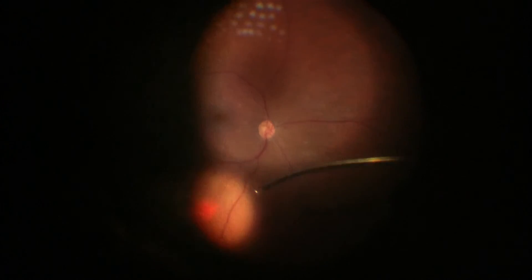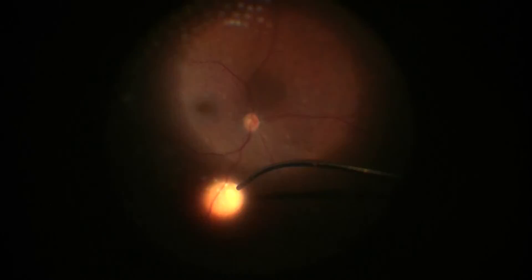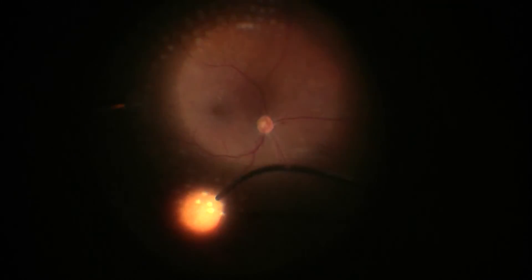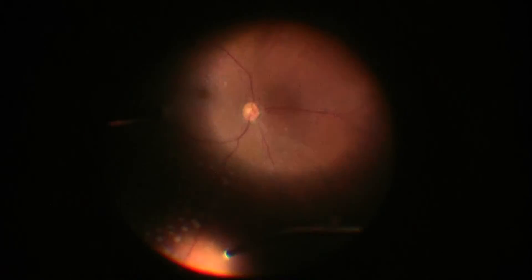We're basically going to go around 360 degrees. You're seeing that I'm going across the eye in order to treat the contralateral retina. This gives me more range of motion and makes it a little bit faster and easier for me. Different surgeons are going to have a different preference as far as how posterior they're going to want that laser to extend. Here, we're getting about a disc to two disc diameters away from the arcade. This patient obviously had a fairly significant vitreous hemorrhage, and so we're going to give this patient the maximal treatment that's possible while still minimizing any visual field defect and nyctalopia that the patient's going to experience. After we've finished this step of the laser, we're going to scleral depress and apply laser up to the ora serrata. That's going to additionally treat the rest of the retina that we can't see by direct visualization here.